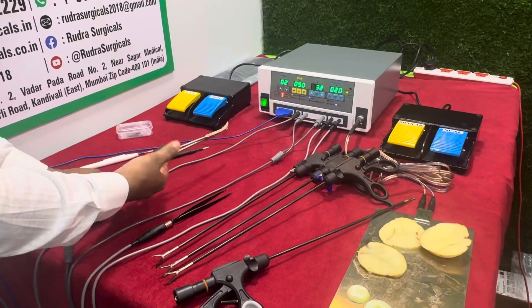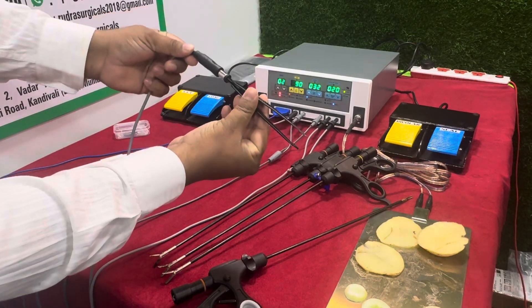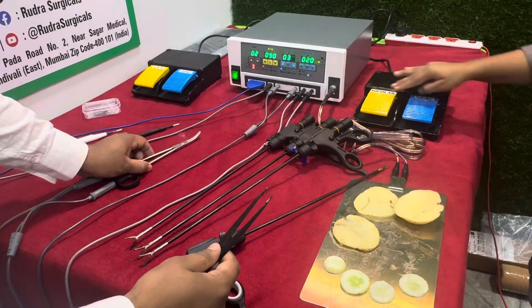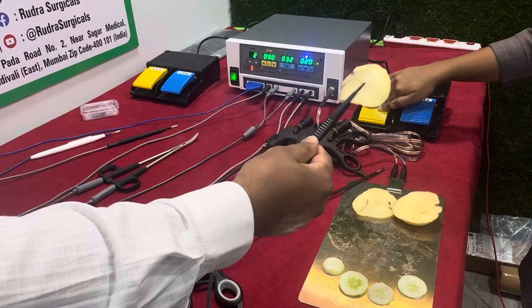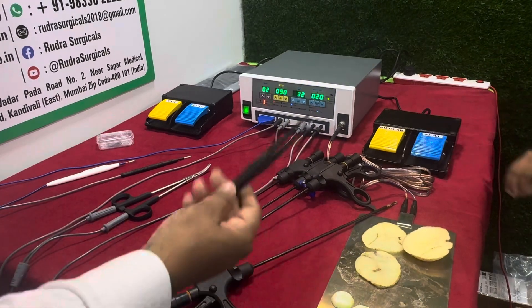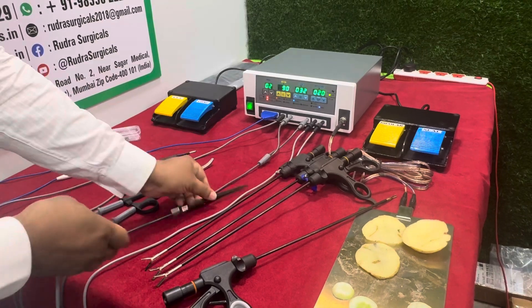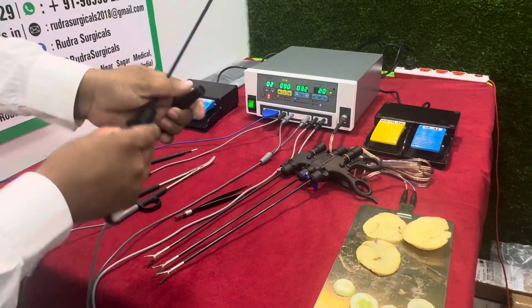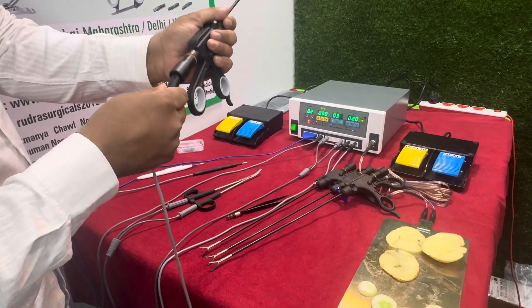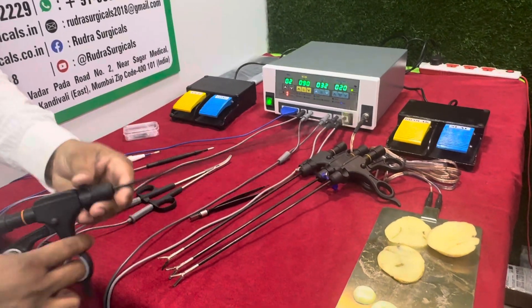This is bipolar forceps with bipolar cable, used for cutting purpose. And this is a bipolar sealer cutter, used for bipolar and cutting purpose.